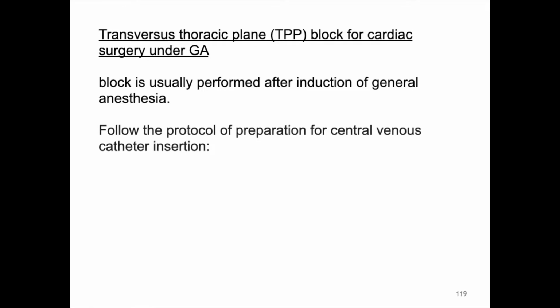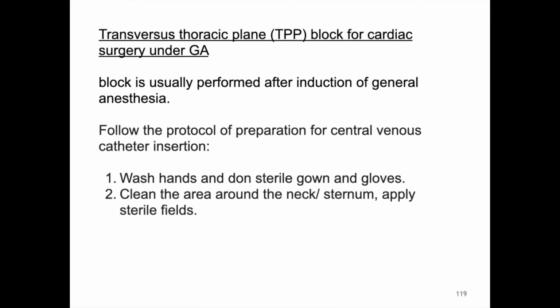Follow the protocol of preparation for central venous catheter insertion. Wash hands and don sterile gown and gloves. Clean the area around the neck and the sternum and apply sterile fields. Apply sterile sheath to the ultrasound probe.